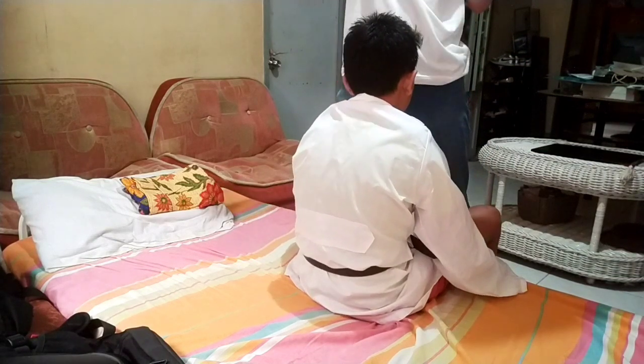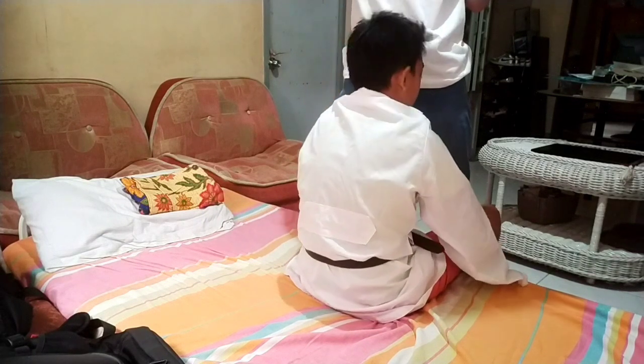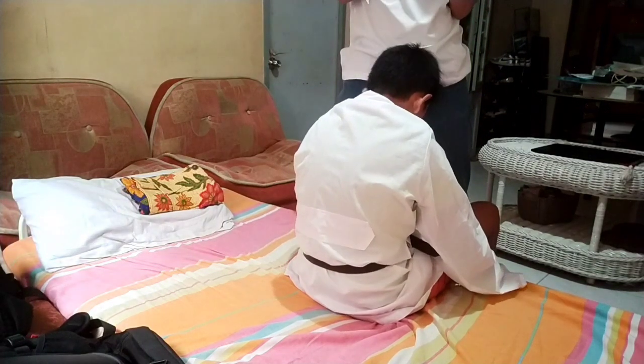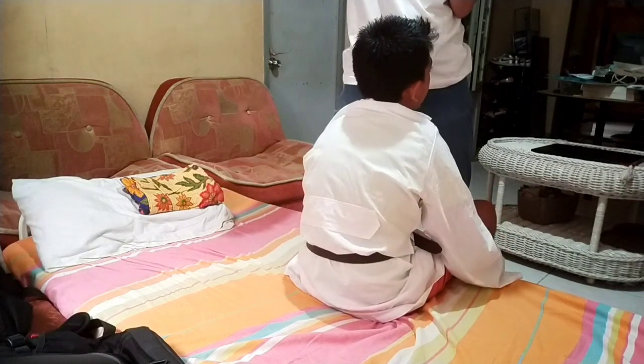So position yourself correctly, stand directly in front of the client and to the side requiring the most support. Hold the gait or transfer belt with the nearest hand. The other hand supports the back of the client's shoulder.